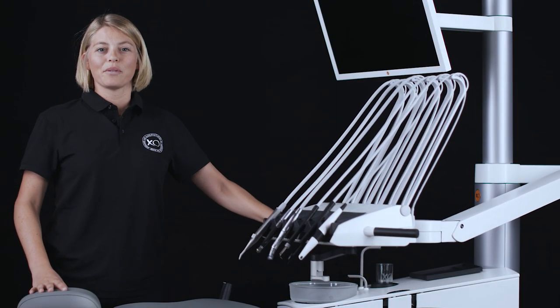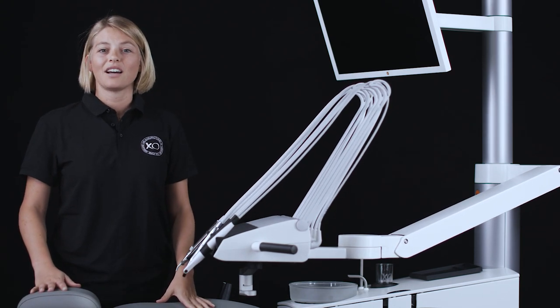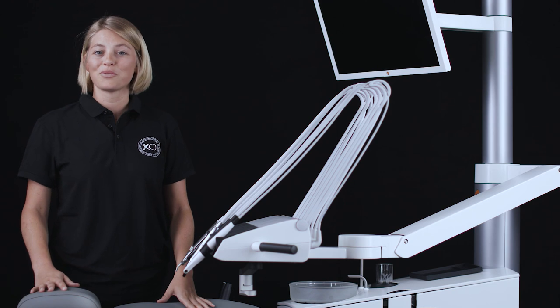This unit is designed with over-the-patient delivery of instruments for working primarily on supine patients. This allows you to see all tooth surfaces in good working posture.